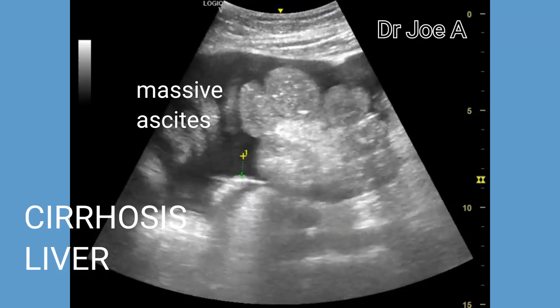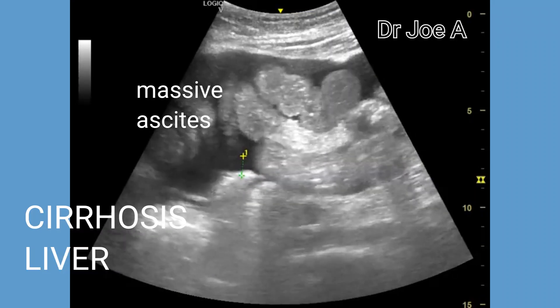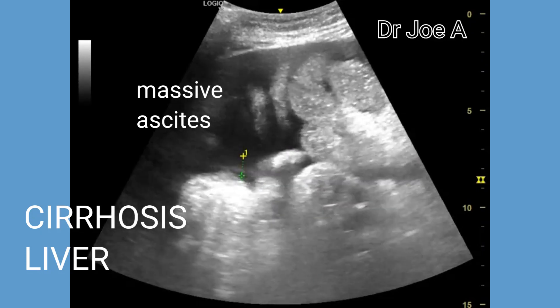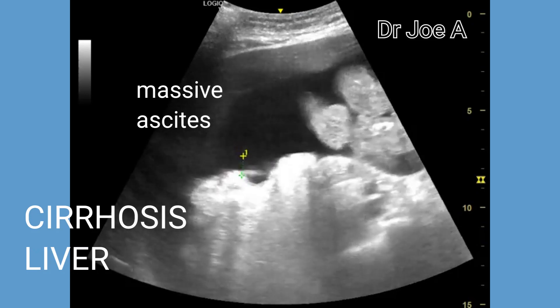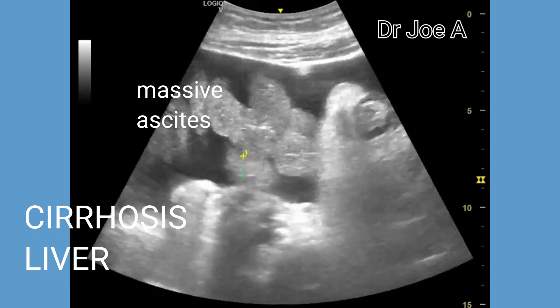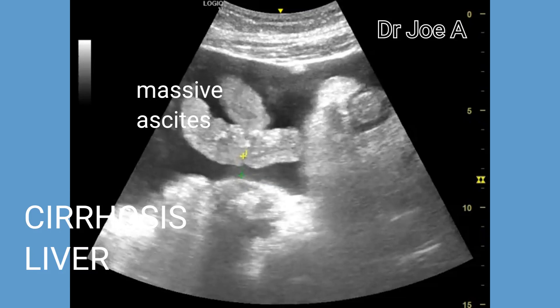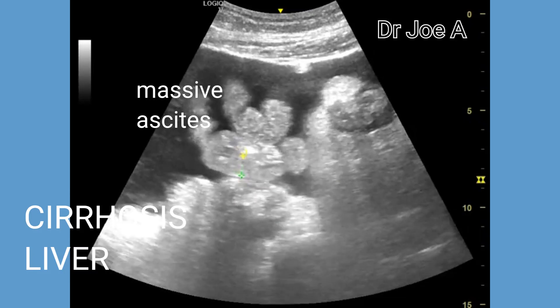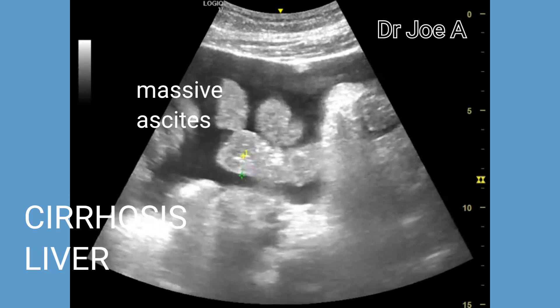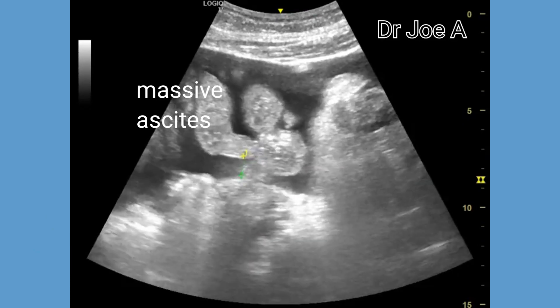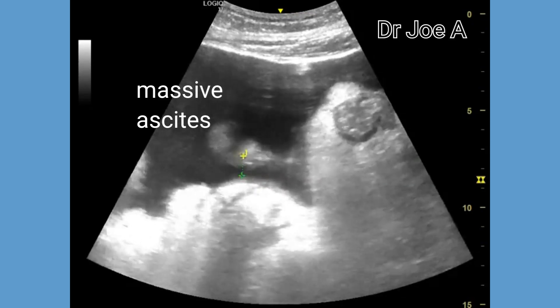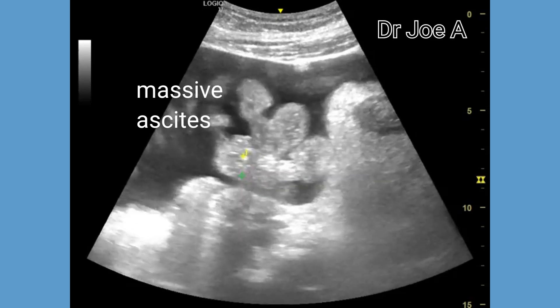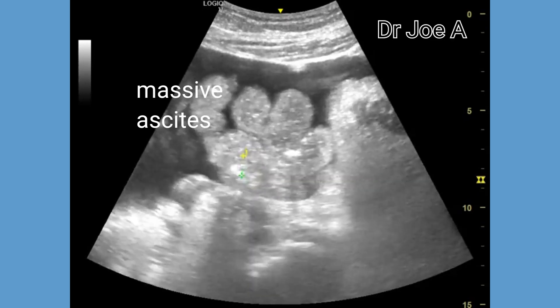This is a patient of cirrhosis of liver who presented with massive distension of abdomen. Ultrasound shows significant ascites. Small bowel loops are seen floating in the ascitic fluid. Fluid is seen extending from the epigastrium and hypochondrium all the way up to the suprapubic region. Lack of particulate matter in the fluid suggests that this is serous ascitic fluid.